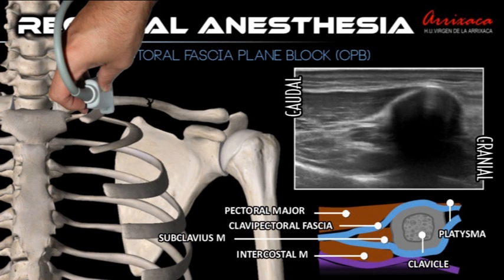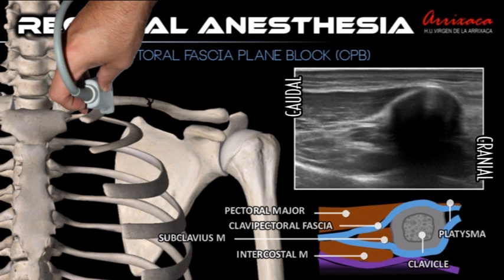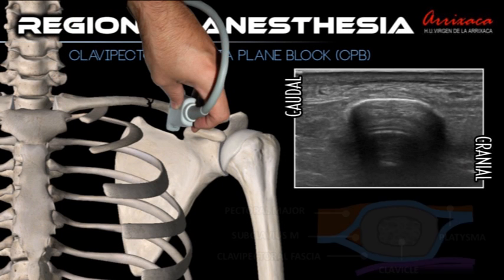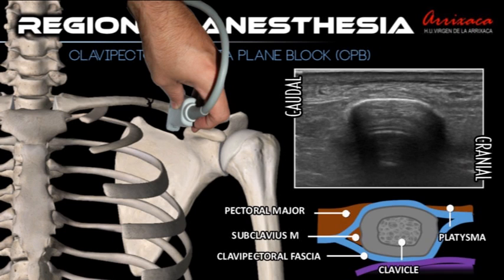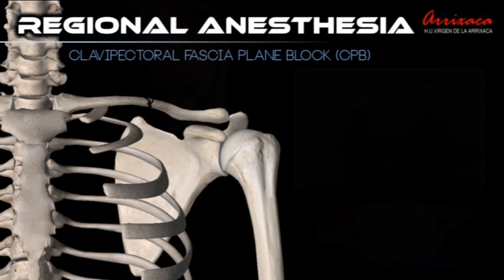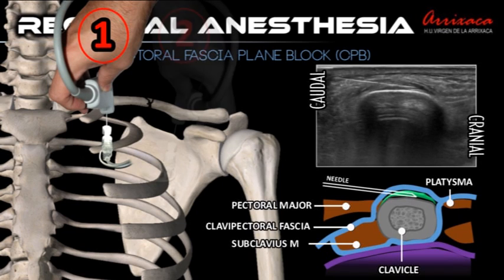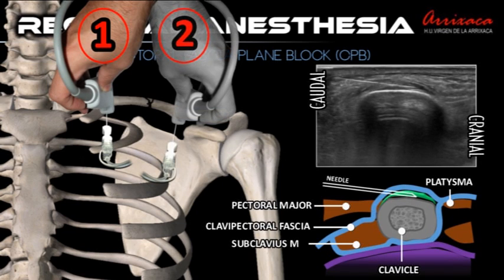The ultrasonographic probe is placed on the anterosuperior border of the clavicle on the medial and lateral side of the fracture. The position of the probe will avoid injecting over the insertion of the pectoralis major, as this would affect the diffusion of the local anesthetic.